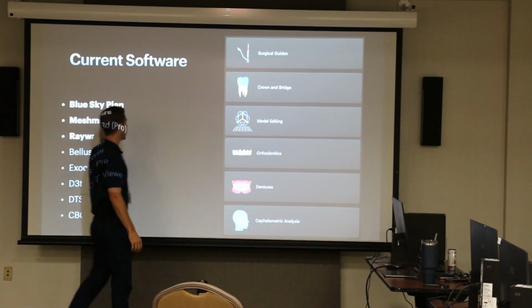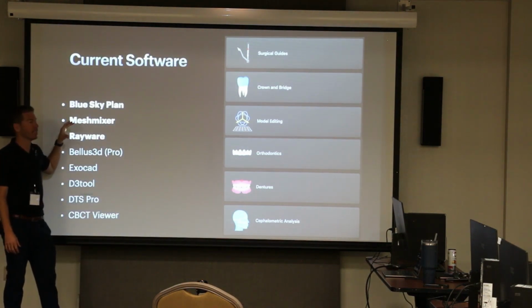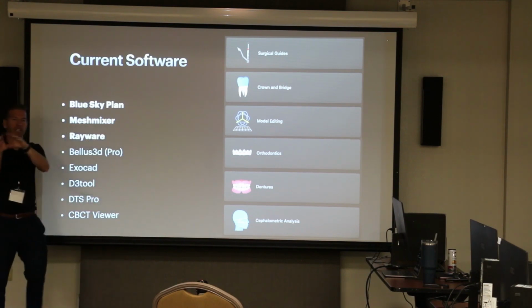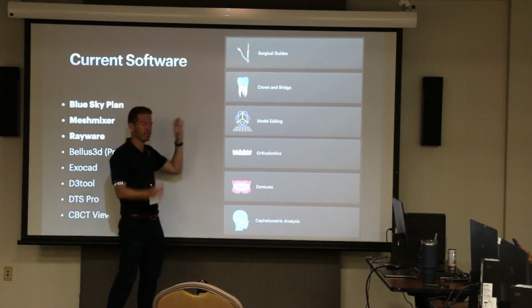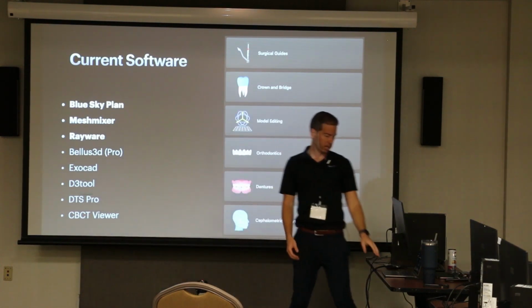Where Mesh Mixer comes in is just when you need a little bit more power behind the edit. So occasionally we'll have to take the file from Blue Sky, move it out into Mesh Mixer, do a more advanced manipulation, and then bring it back in. But our goal is to try to keep things simple under one software. So the model editing is where we're going to be working today.